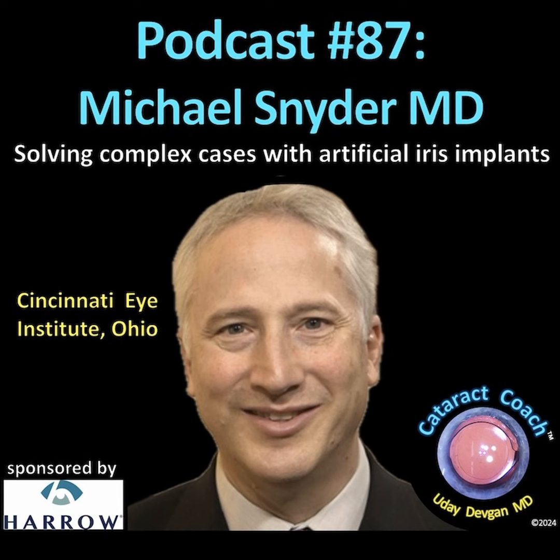It's interesting also to learn from experience, like you said, making relaxing cuts in the periphery of it. Well, no, that's when the capsular bag is going to contract. You're going to wrinkle the implant, the iris. And at one point, we actually had a debate about whether we needed to put capsular tension rings in the congenital aniridics, because congenital aniridic capsules are so fragile and so thin that we worried that we might break the capsule by putting a ring in. So like, well, maybe we don't need them since these capsules are so thin. Well, guess what? You need it. You do. Ask me how I know.